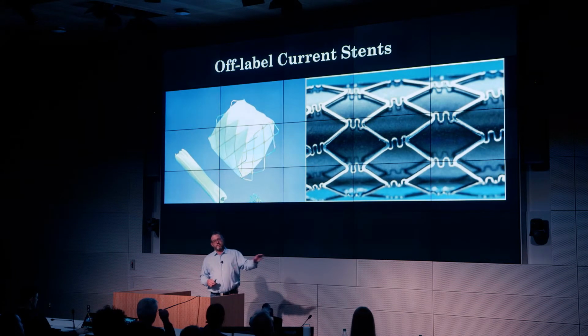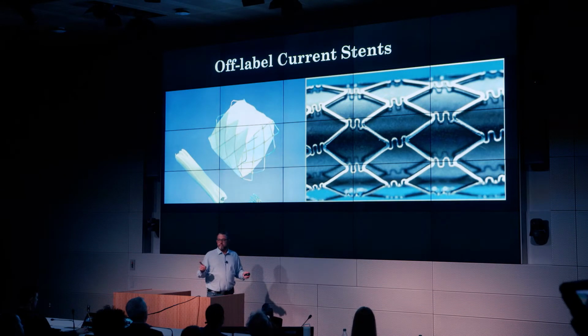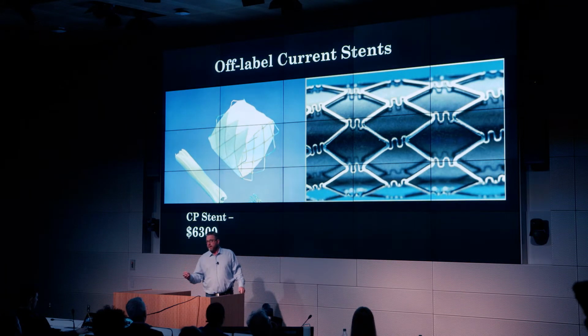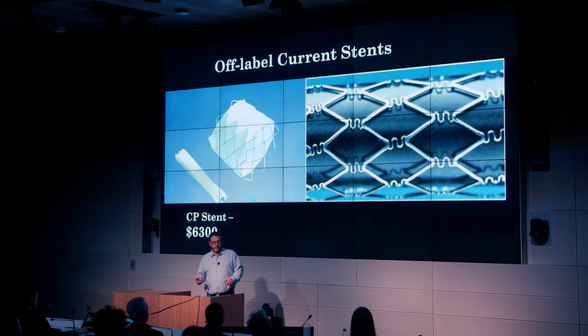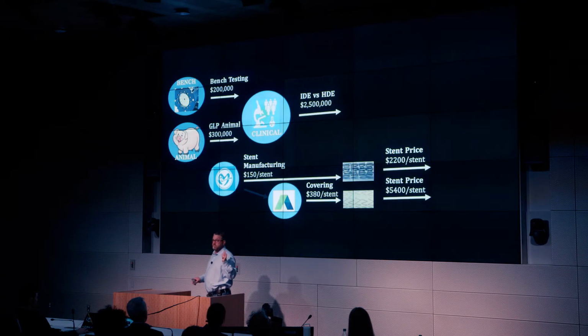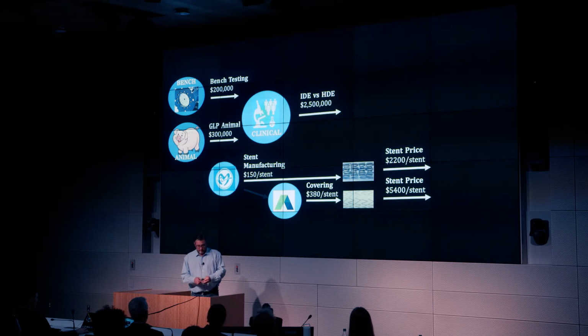These are the devices we use now. The first stent is really the only covered stent we have. It's really inappropriate for children. You see the Gore-Tex is just kind of wrapped around and stapled on the stent. We get away with this stent, but it's not what we need. We also use uncovered stents that are actually approved for the bile tract, like, you know, what that green stuff goes through in your gut. So we're using biliary stents now to stent little kids, and we're paying a lot for these stents.